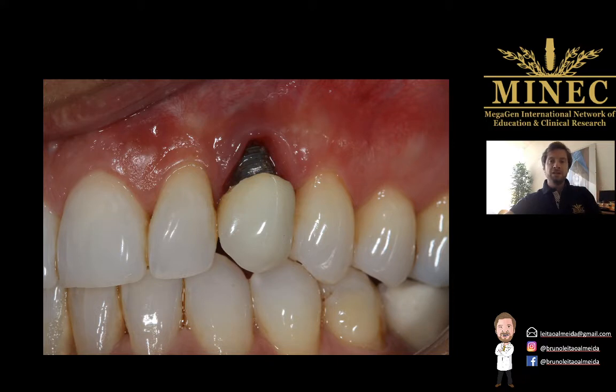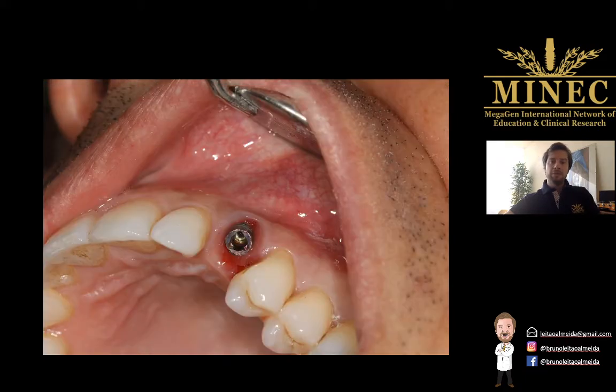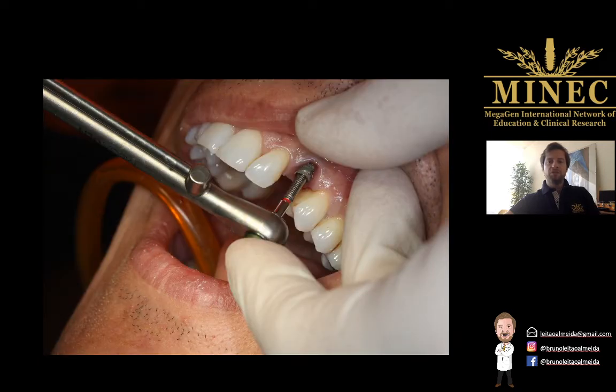So the first thing is to remove the crown. So we search for it using a burr, we identify it, unscrew, and we have the implant. Funny enough, it's also a 3-channel implant. So we install our fixture removal, we connect the Torx drive, and we over torque this fixture removal.